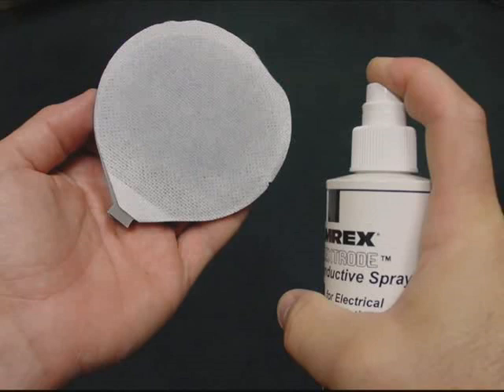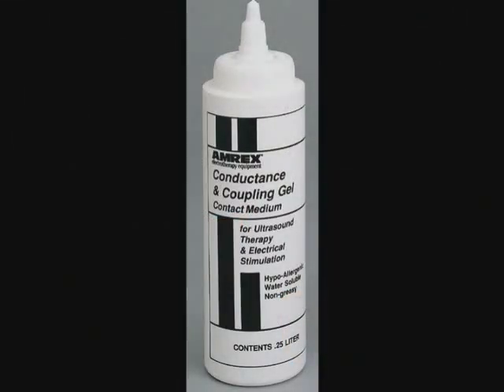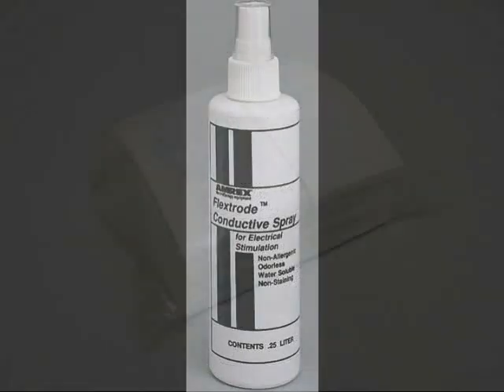The treatment site and electrode should be cleaned and properly prepared prior to application of electrical stimulation to the patient. We recommend that you use AMREX conductance gel or Flextrode conductance spray and cloth covers to thoroughly moisten the treatment site and electrode surface prior to every treatment.